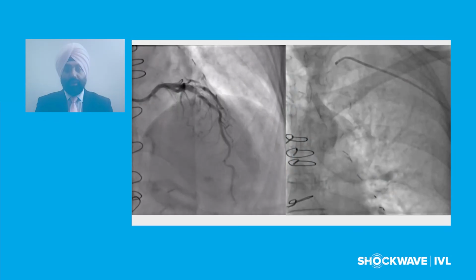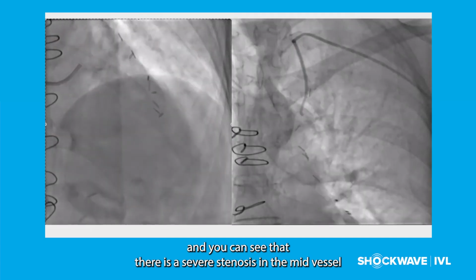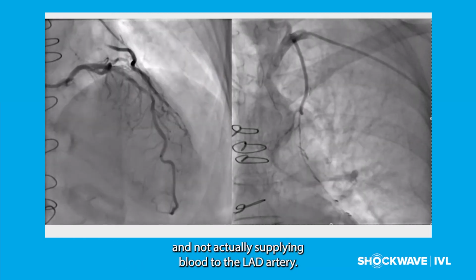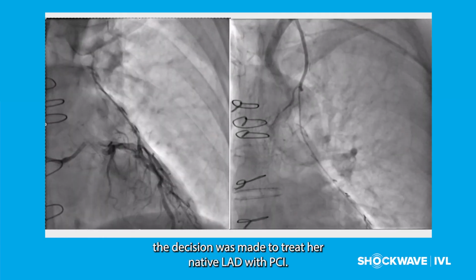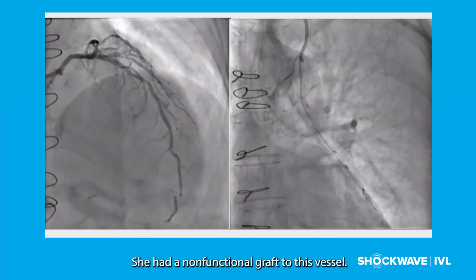So as we can see, the panel on the left now is the native LAD, and you can see that there is a severe stenosis in the mid-vessel, and on imaging the LIMA graft on the right panel, you can see that this is functionally occluded and not actually supplying blood to the LAD artery. So after discussing this lady's case, a decision was made to treat her native LAD with PCI as she had a non-functioning graft to this vessel.